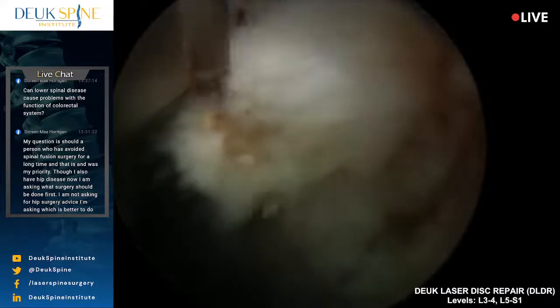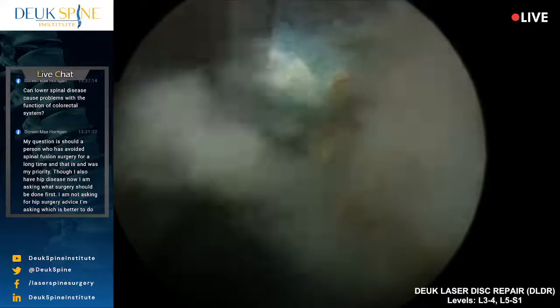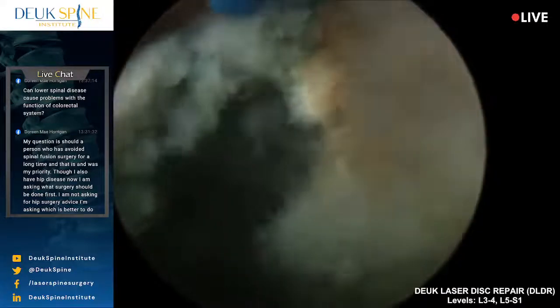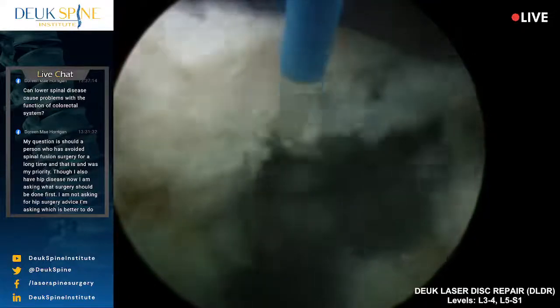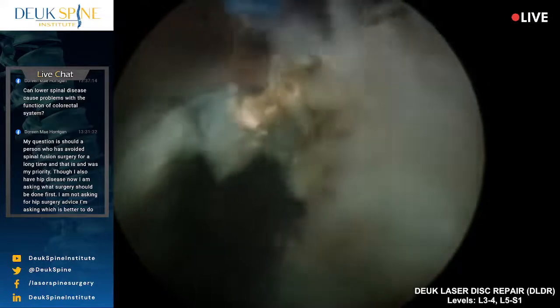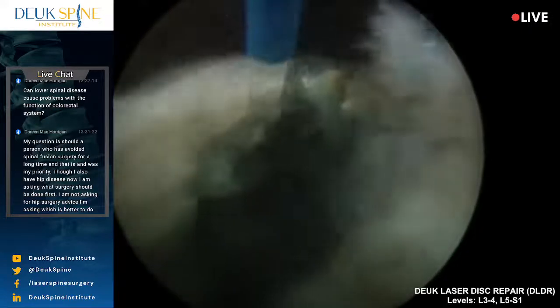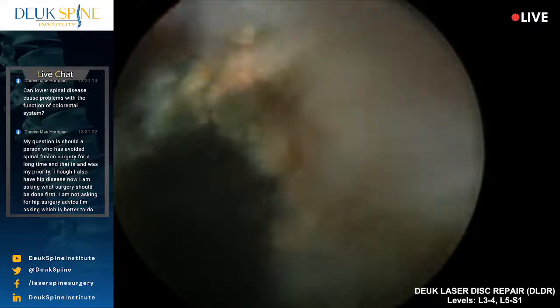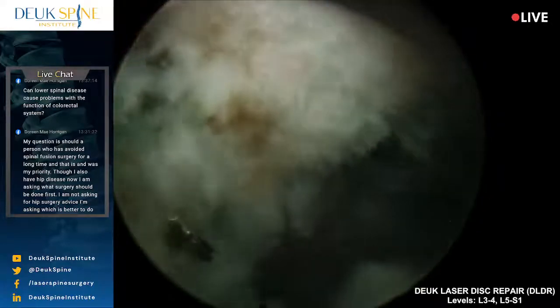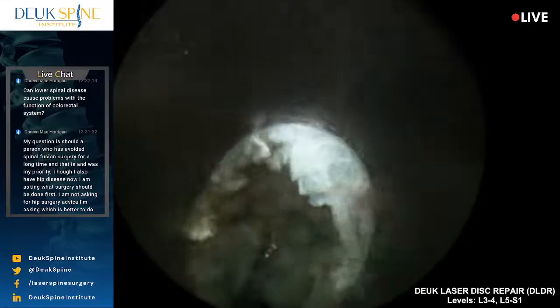This is, once again, L3-4. We're on the patient's left side, and we're going to do the, I think, what should we do, Luis? Do we go 5-1, or should I finish the right side L3-4? Finish 3-4. Luis, no, we're going to do that. So we're going to switch to the other side of 3-4 in just a second. I'm just cleaning up the last of this interposed herniation. Okay? Coming back. Let's take a look.